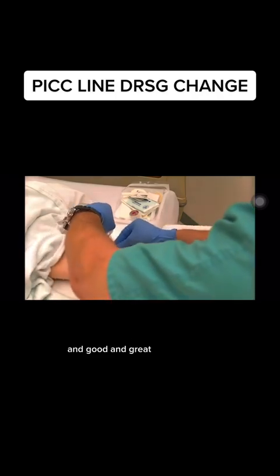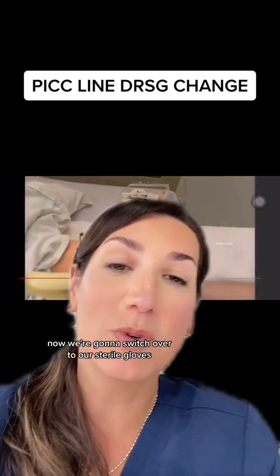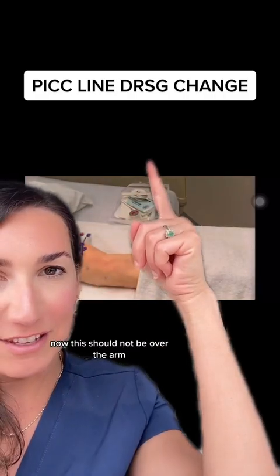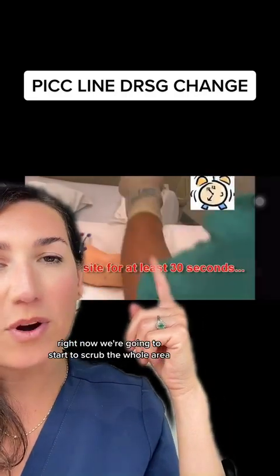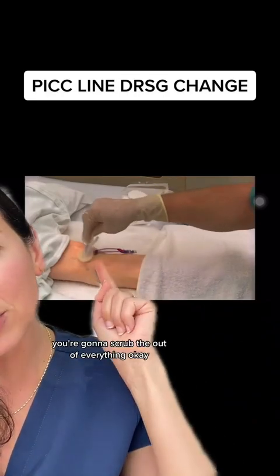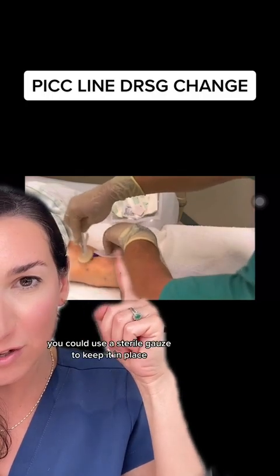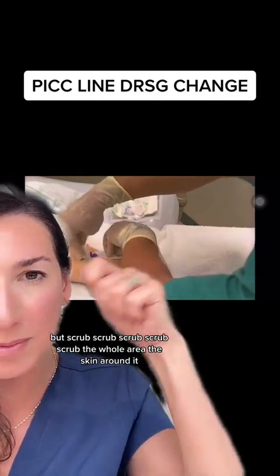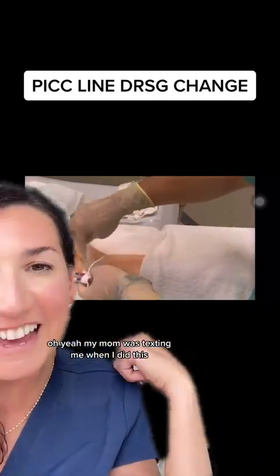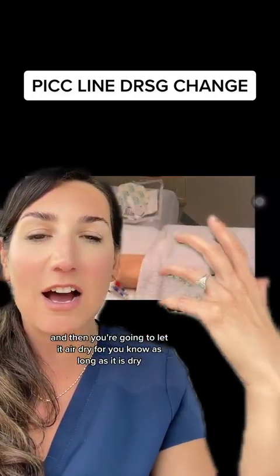Now that you've got everything off, switch over to your sterile gloves. Your supply tray should be right next to you, not over the arm. Now it's time to scrub the whole area for at least 30 seconds — really scrub everything well, but not so violently that the line gets dislodged. You can use a sterile gauze to keep it in place. Scrub the skin all around the insertion site, then let it air dry completely.